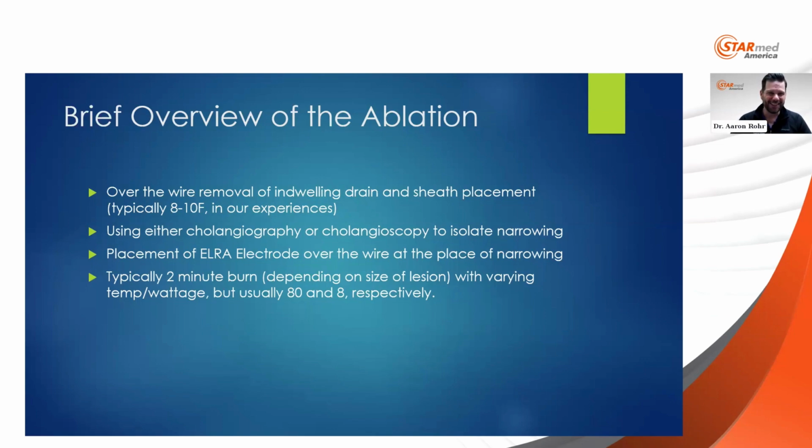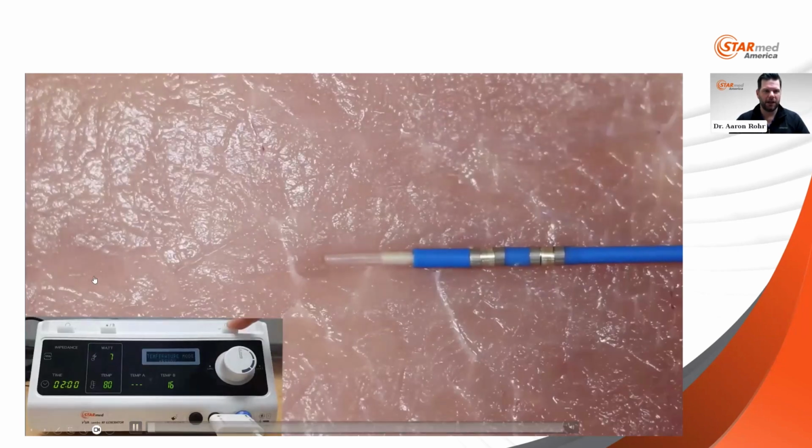I specifically did not want to say this is the only way to ablate, because every physician will have their own approach. IR is an art form in my mind, and I stand by that. So everybody will have their own way to do these. This is what I've found in my experiences. This is a brief video showing the entirety of that 2-minute process.